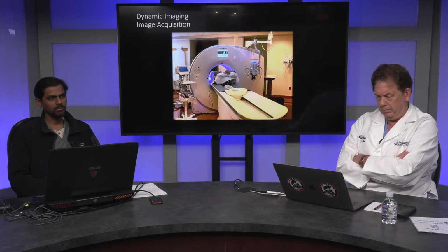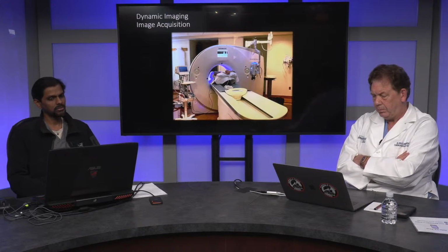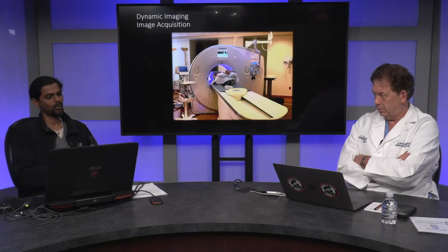Yeah, so there's one more thing I would like to add to that, Dr. Lumsden, is that we are now moving from qualitative imaging to quantitative imaging. Especially with CT, with these time attenuation curves, or even when you go to MR, we have these time-resolved sequences. You can get the same information there, and now with the latest 4D flow sequences, we can really measure the physiology. So I think this is where we are changing the realm, especially in aortic dissection, not just morphological, but also getting towards functional, physiological imaging.